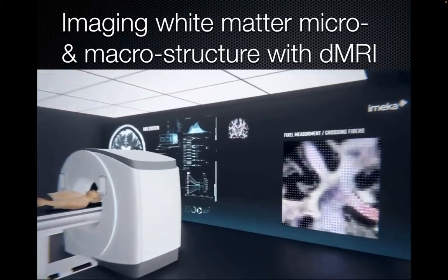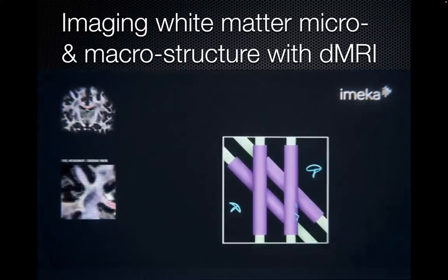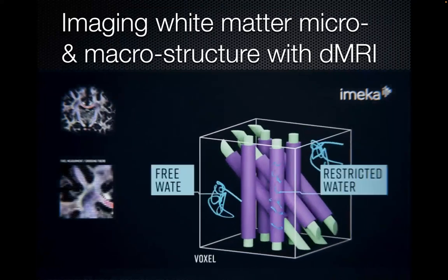We're going to acquire a bunch of images and essentially be able to be robust to crossing fibers as well. Remember my first video about the parties on the streets? Because our voxels are so big, right? We're at the MRI resolution. This is on the order of millimeters, and these axons on the order of microns.